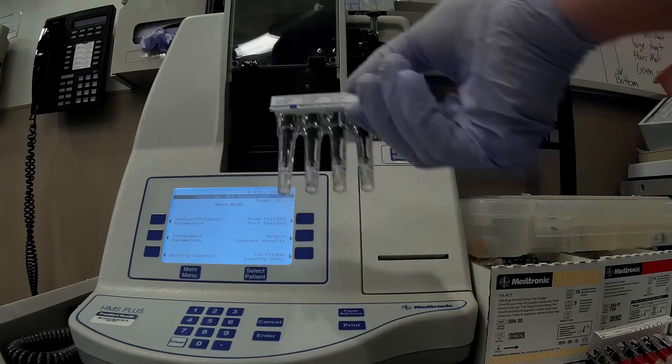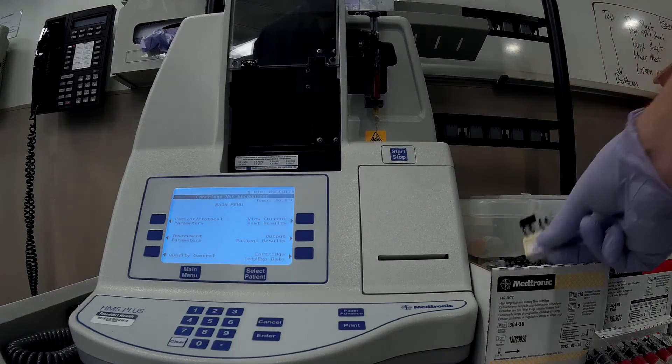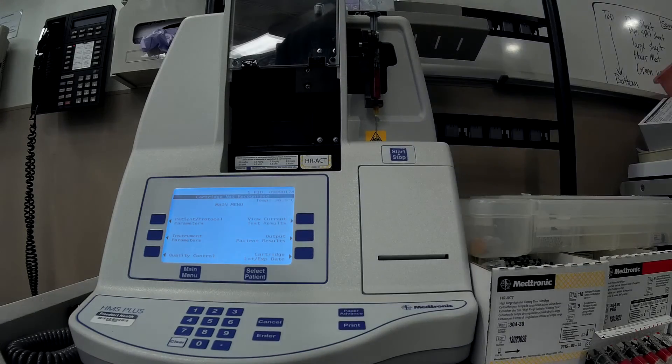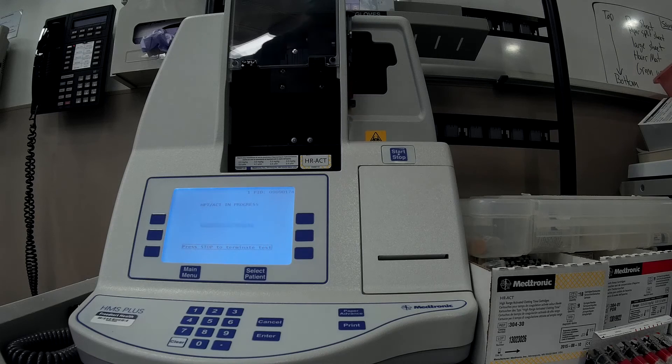Insert the heparin assay cartridge into the machine and do the same for the ACT cartridge. Press start on the machine and then press start again to continue. The machine will now dispense blood into each of the wells and generate the heparin concentration and ACT.